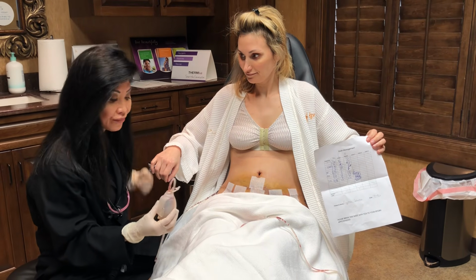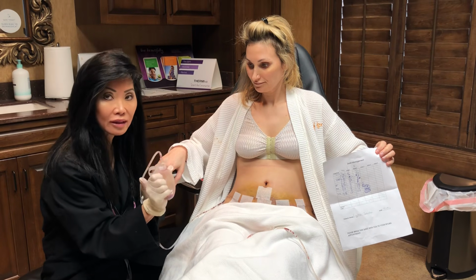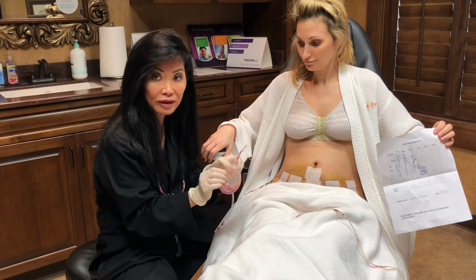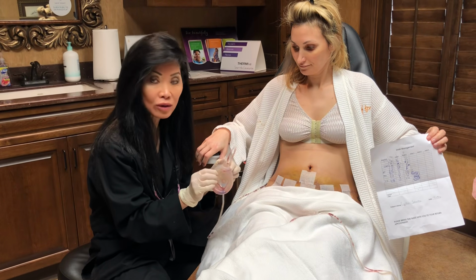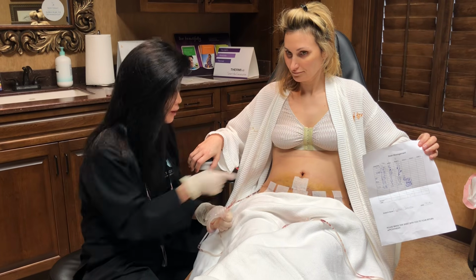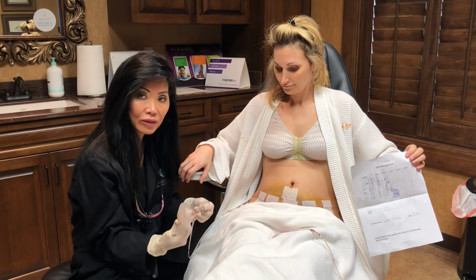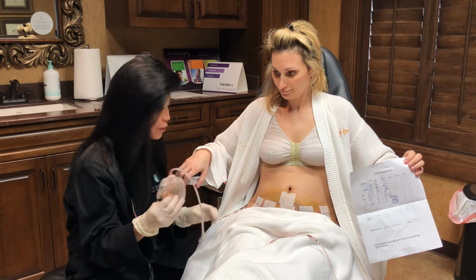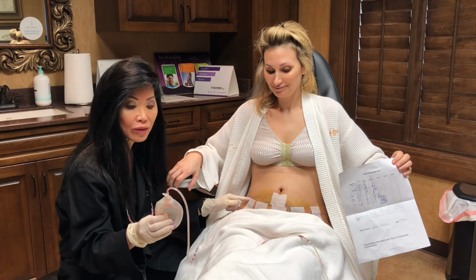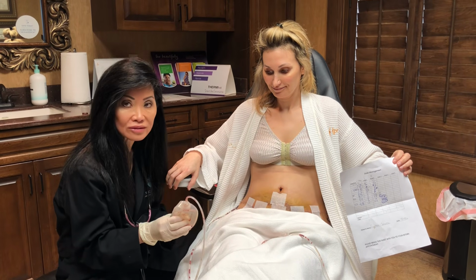Typically, we will always want the drain tube to be collapsed like this so it will suction the fluid into the drain tube or in the bulb. If it's not collapsed, it's not working, so it's not taking any fluid out of the wound, okay? So basically that's how we take care of the drains, and what we want to do after the post-op care is keep the drain tube open, and also make sure we get all the fluid out so that you'll heal faster, okay?